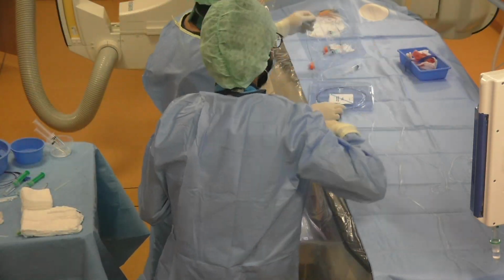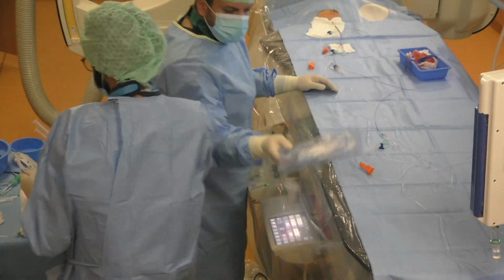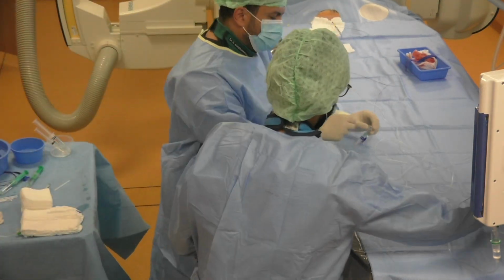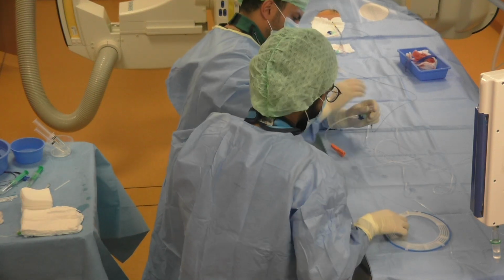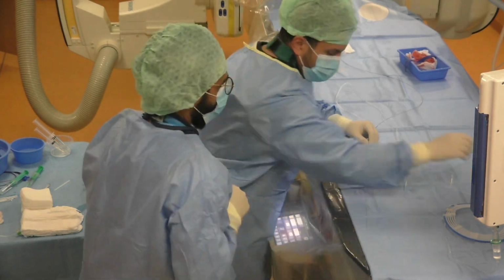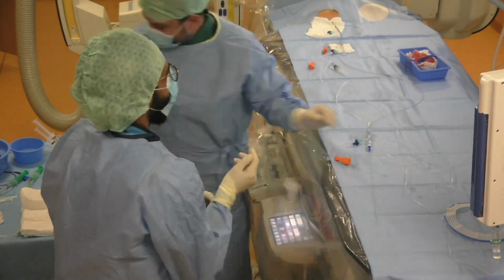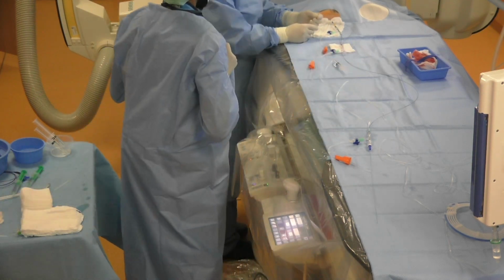And now we're preparing the microcatheter and microwire. This is the Excelsior SL10. And we're pushing the microwire inside the Excelsior SL10 microcatheter. And now we shape the tip of the microwire.